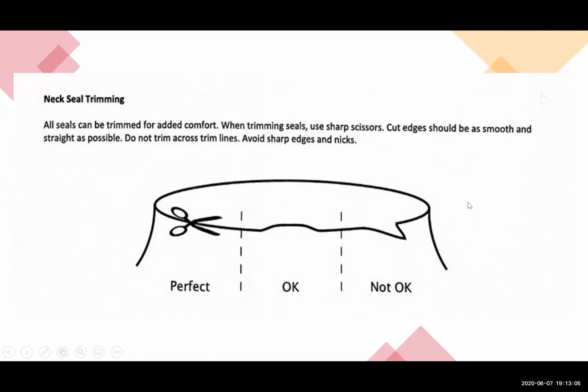We recommend that this trimming process gets performed very accurately, as if you induce a break in the rim of the collar, that might lead to tearing the whole collar and eventually losing the whole helmet, or creating folds in here that are going to prevent you from obtaining an optimized seal around the neck.